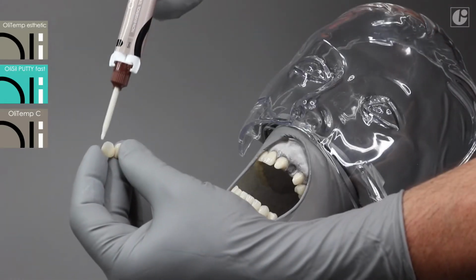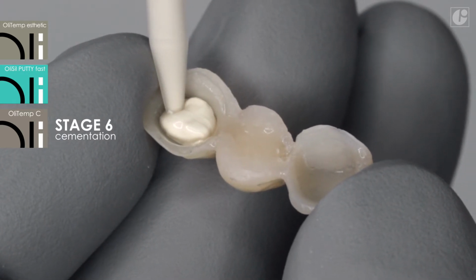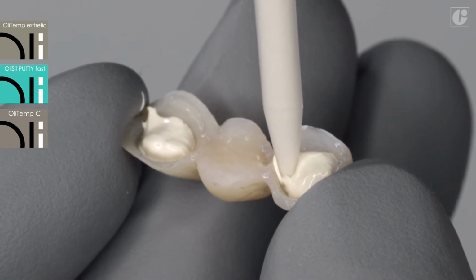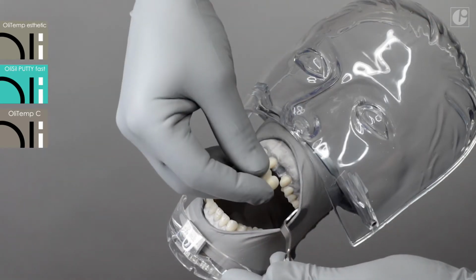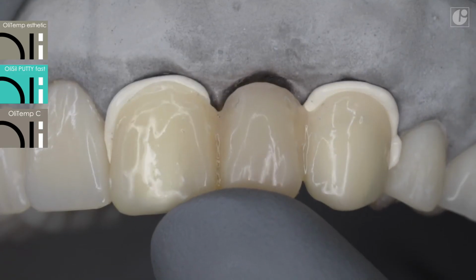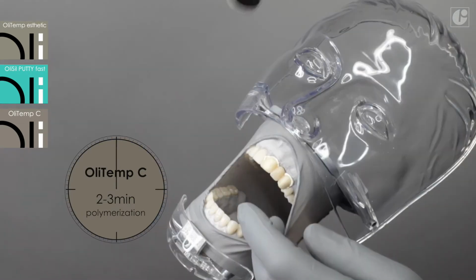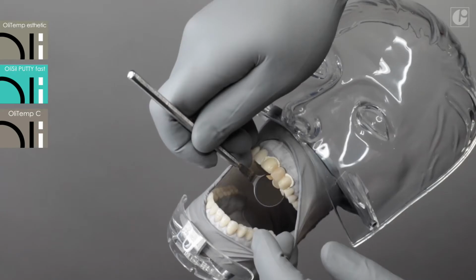Apply an appropriate amount of the cement into the prepared temporary restoration and then transfer to slightly damp teeth and press it down. Excess cement can be removed after about 2 to 3 minutes.